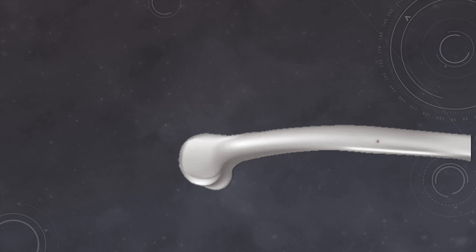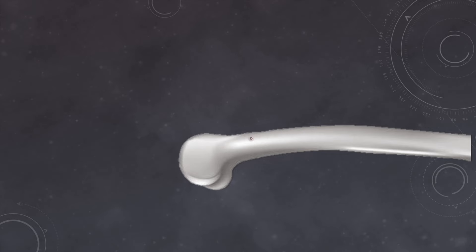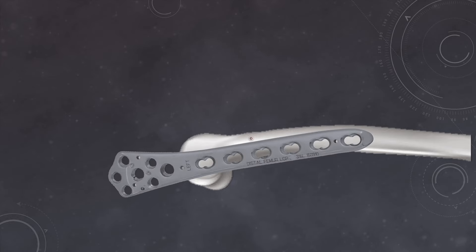The femur is not in a straight line — it is bowed. So we have to slide the plate or the Cobb's elevator in such a way that we keep on feeling the bone while sliding it proximally. Similarly, we can use the plate and slide it while feeling for the bone. Even if the terminal part of the plate is not perfectly positioned — meaning it is coming anteriorly or posteriorly — you need not worry, because there are simple techniques by which you can centralize the plate in the proximal fragment just by using the locking sleeves.